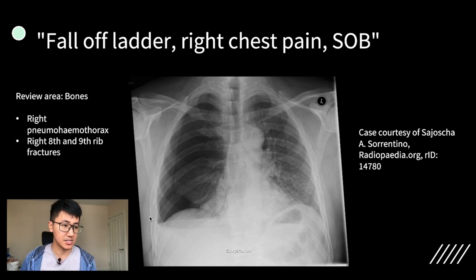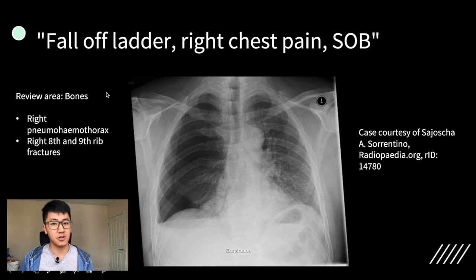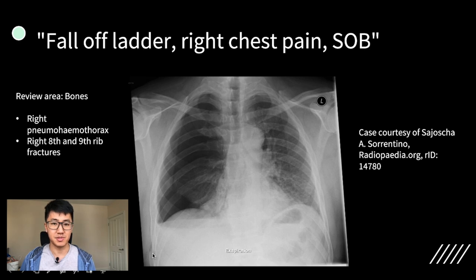The other area to make sure you look at is bones, because rib fractures can cause pneumothoraces. In this case, you can see eighth and ninth rib fractures. As you're following them along, you can see that the cortex of the bone is not in continuity. Also, if you correlate it with the clinical history, they've probably fallen off a ladder, broken some ribs, and those have caused the pneumohemothorax.